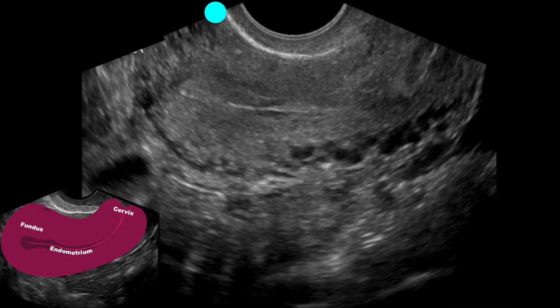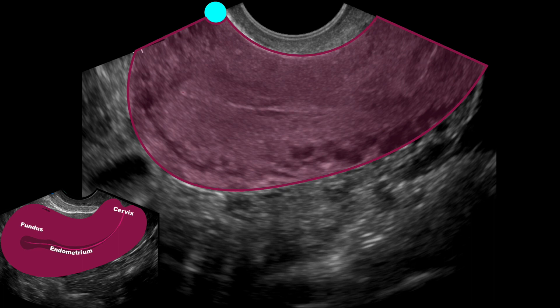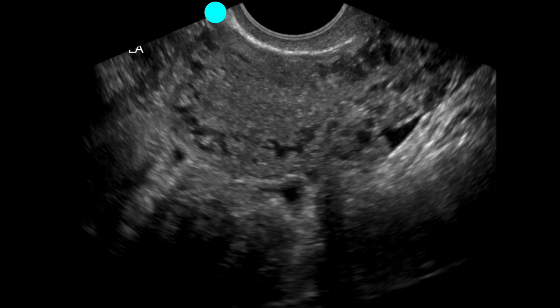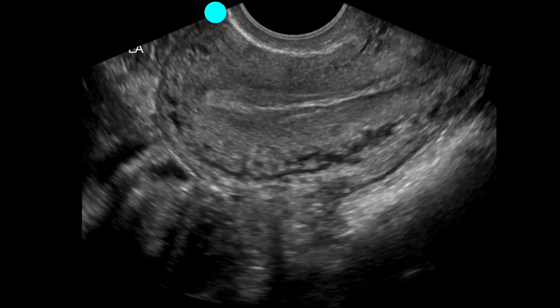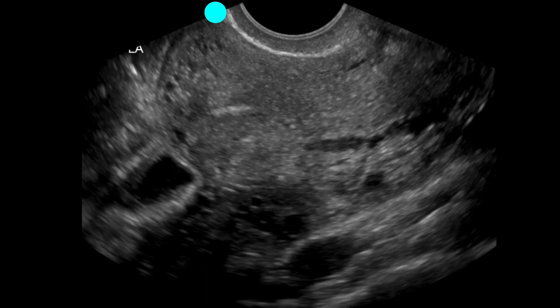Our first view is the long axis. The probe marker is towards the patient's anterior side, so we're oriented anterior-to-posterior and head-to-feet. Outlined is the uterus with the endometrial stripe. We are scanning from the patient's right to the left, focusing on the endometrial stripe as well as any physiological fluid or masses previously identified in the abdominal exam. We keep focus on the endometrial stripe as we scan.